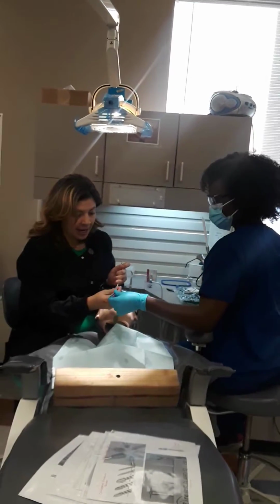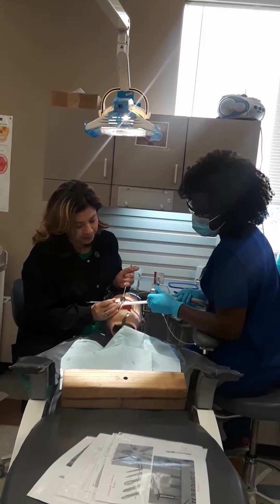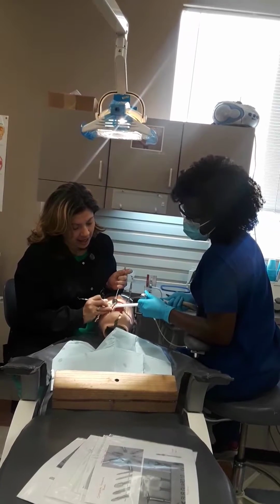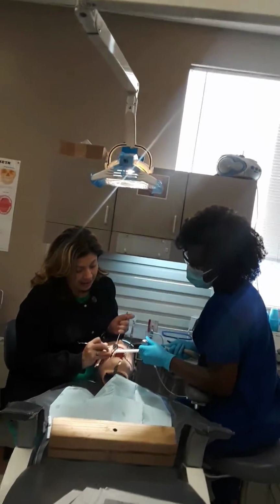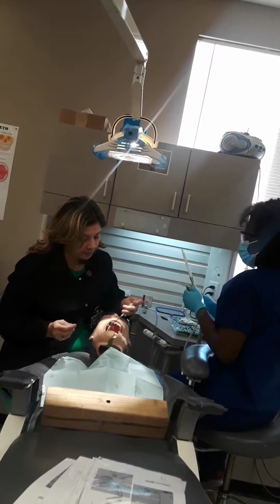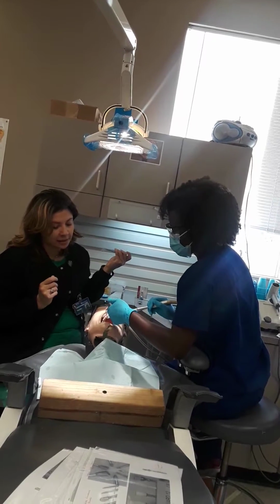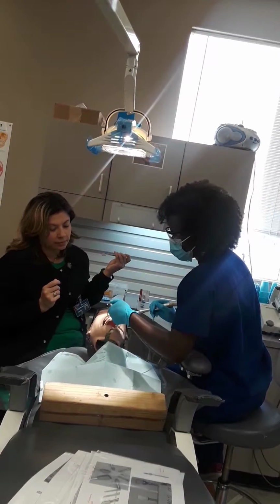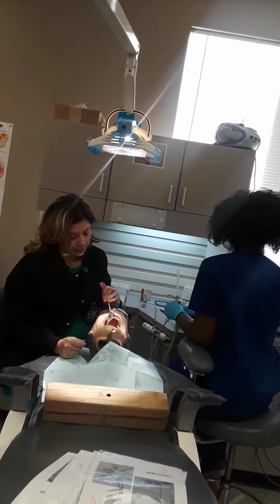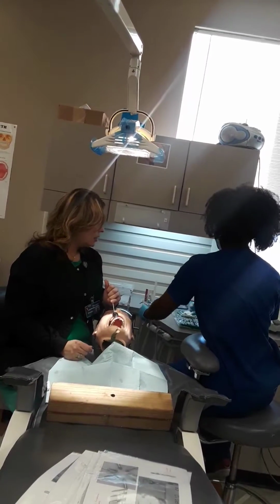Now, if my refining instrument, if my prep isn't even, if it has corners and dips and ledges, we have to make those even, otherwise our filling will look horrible. And then rinse and dry, because those were hand cutting instruments. Yep, and the next, what does it say?